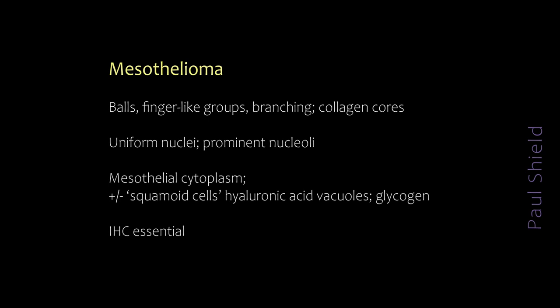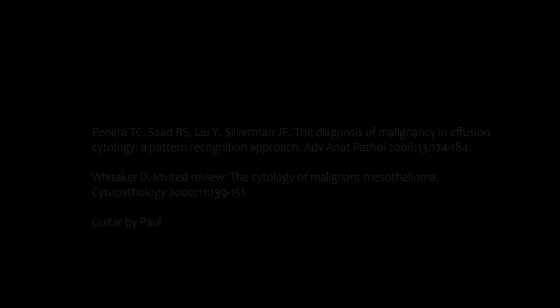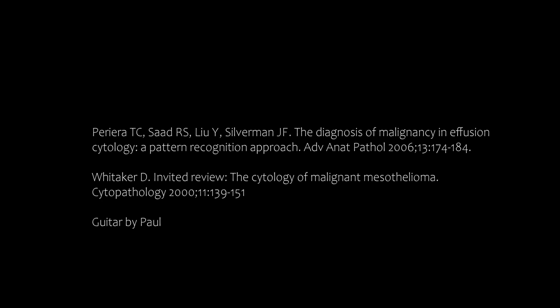As I said, this is a difficult diagnosis, and immunohistochemistry is essential in helping to prove that it's not adenocarcinoma and that it is mesothelioma. We would always suggest biopsy to confirm that.